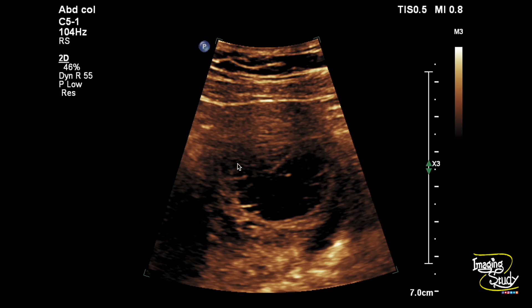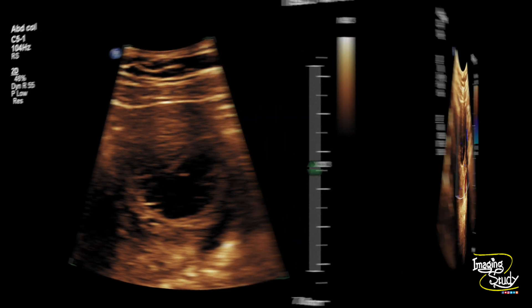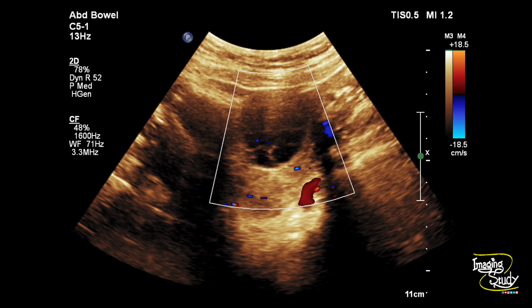If you do transvaginal ultrasound, the picture quality would be better. Here's a picture on Doppler showing no internal or any prominent peripheral flow.